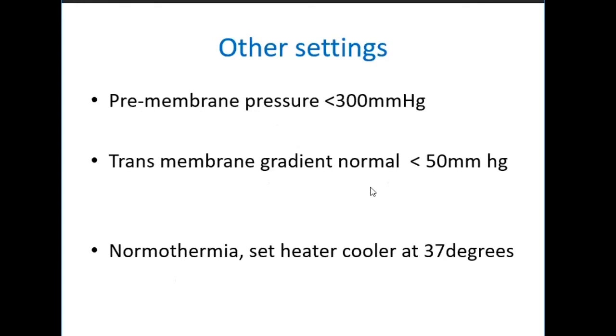What is pre-membrane pressure? We can say that there are 3 pressure points. If you look at the ECMO, one is the pre-pump pressure, then you have the pre-membrane pressure, and then you have the post-membrane pressure.